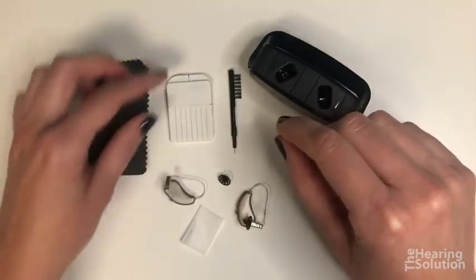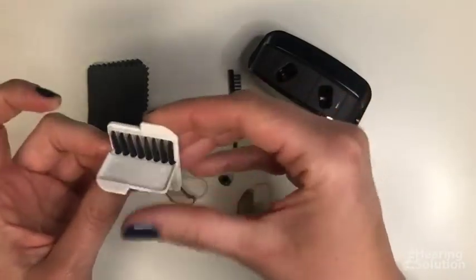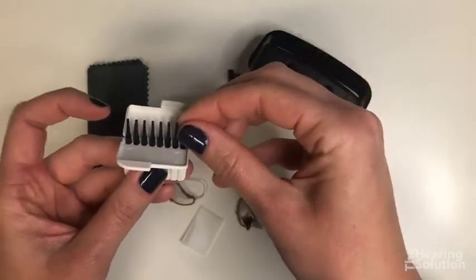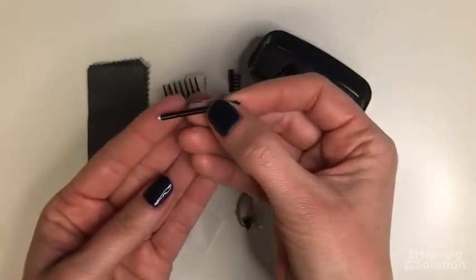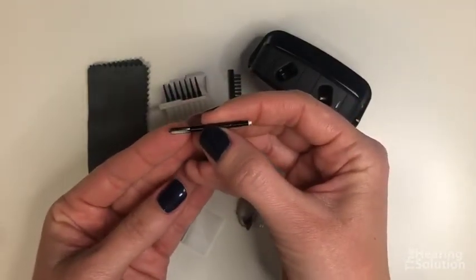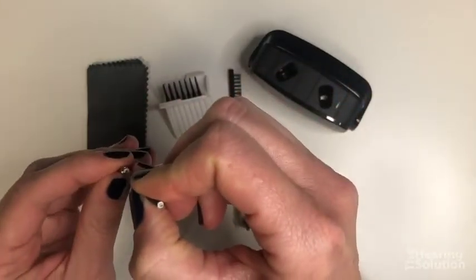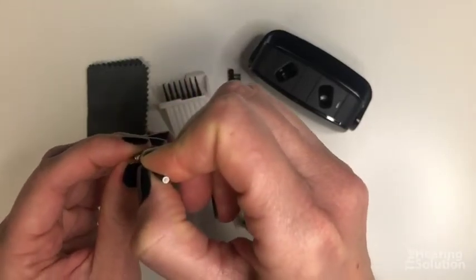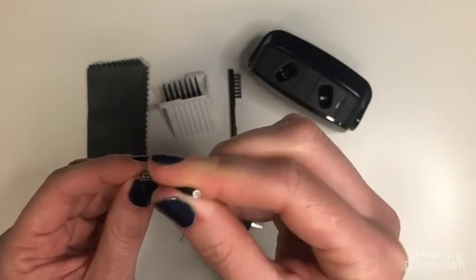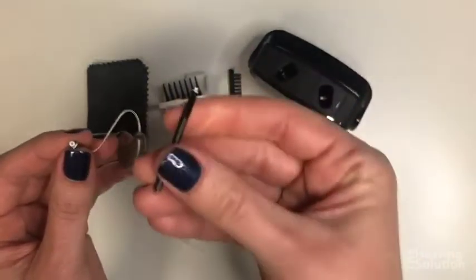Take your wax filter tool — it opens up like a coin purse. You'll have eight sticks. Each stick has a new clean filter on one end and a barbed tip on the other. Insert the barbed tip straight into the dirty wax filter and pull it straight out. Flip the stick over, insert the new clean filter straight into the hole, and it'll stay in place. Then throw the stick away.